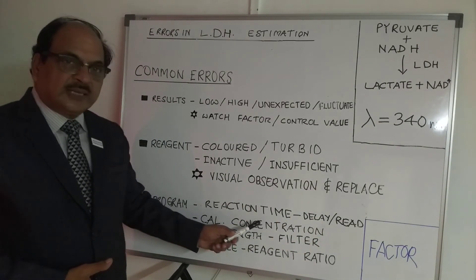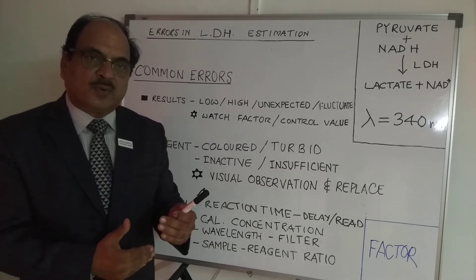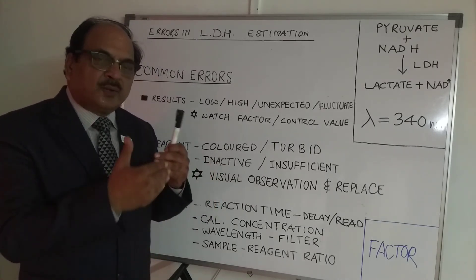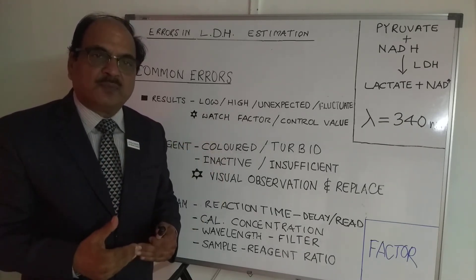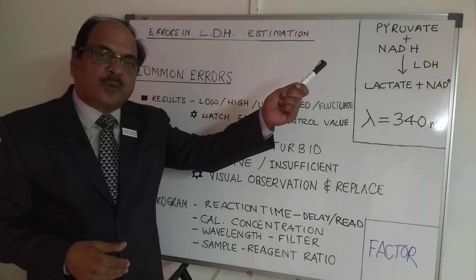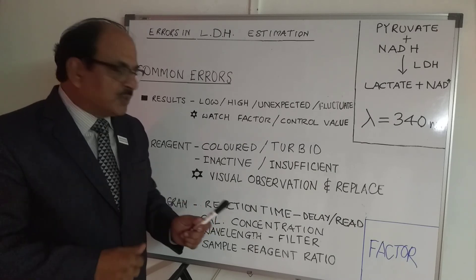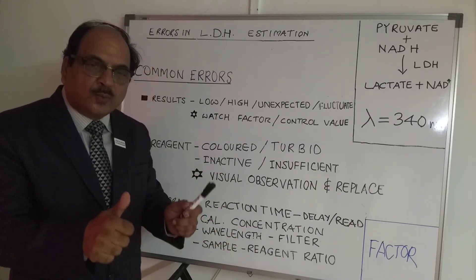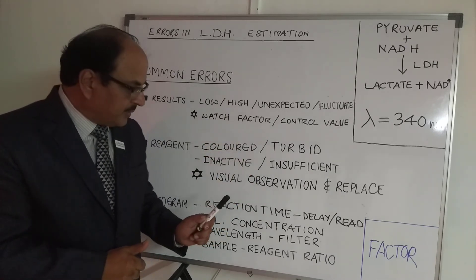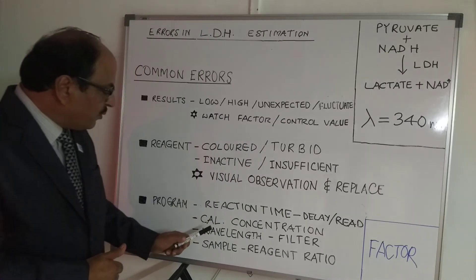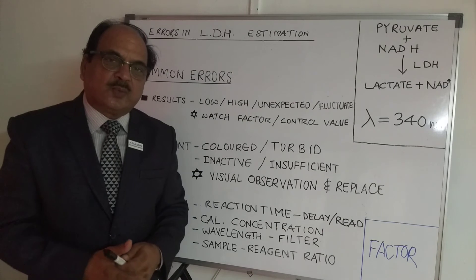Calibrator concentration is another important area prone to error. A common mistake is forgetting to update the calibrator concentration when switching to a new lot — if the previous calibrator value remains in the program, the factors and results will be wrong. Ensure that the current calibrator value for the new lot is correctly entered into the program.